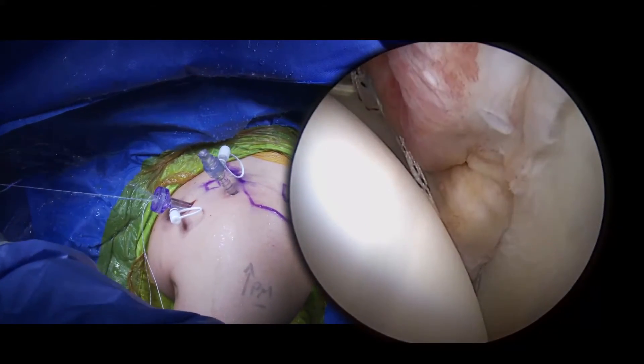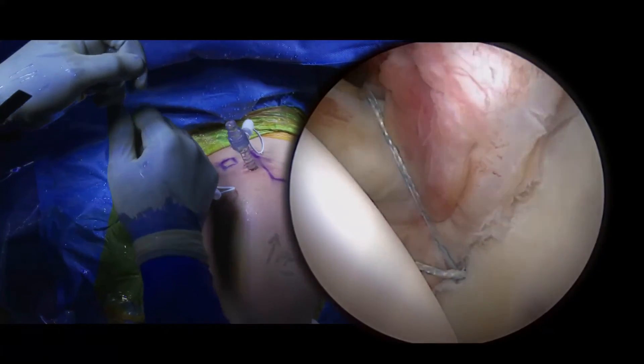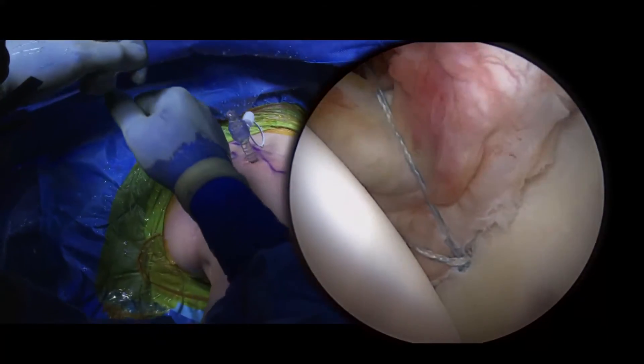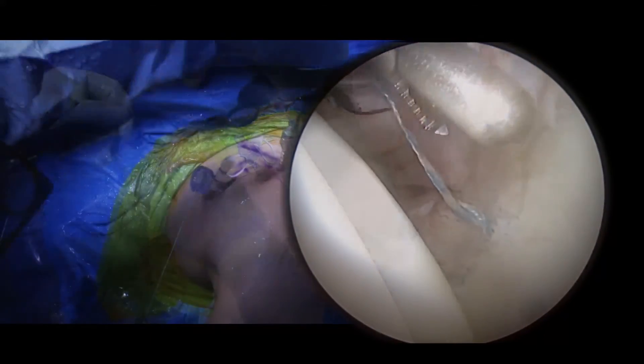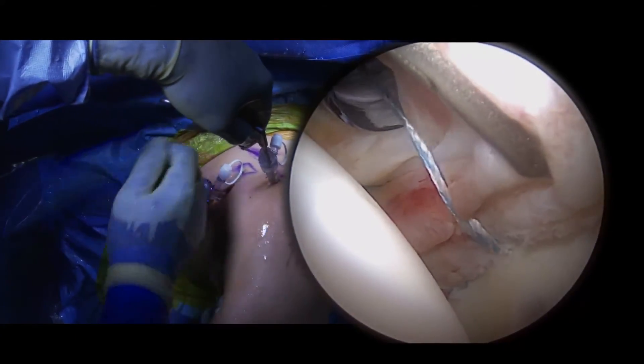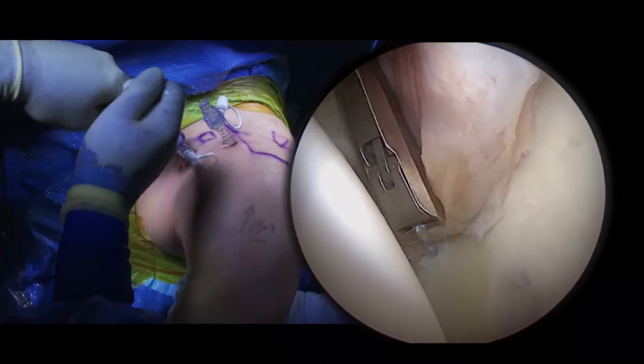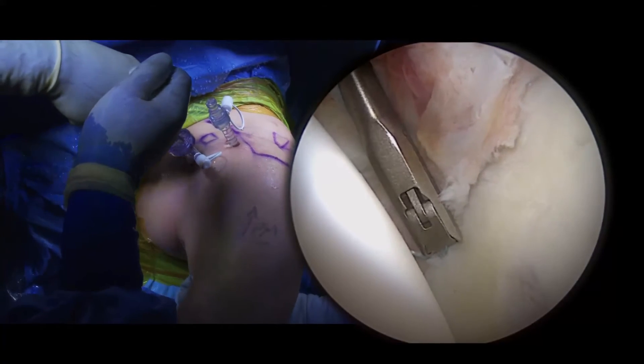The first step is pre-tensioning the anchor. An arthroscopic grabber is then used to grab the capsule to allow for anatomic reduction next to the face of the glenoid. The suture is then cut flush to the face of the glenoid.